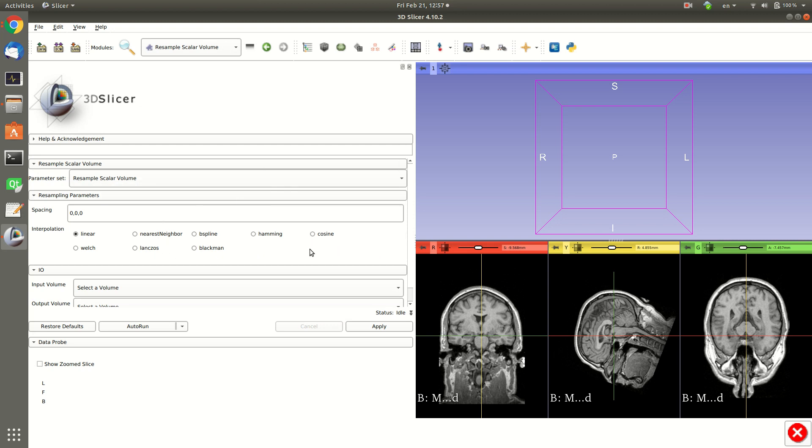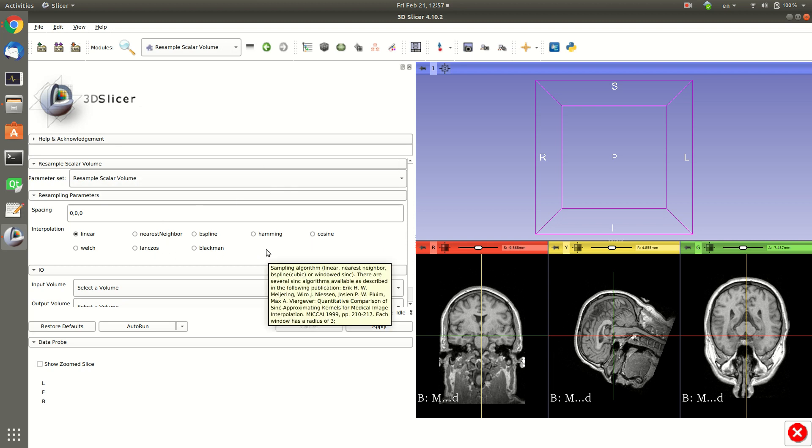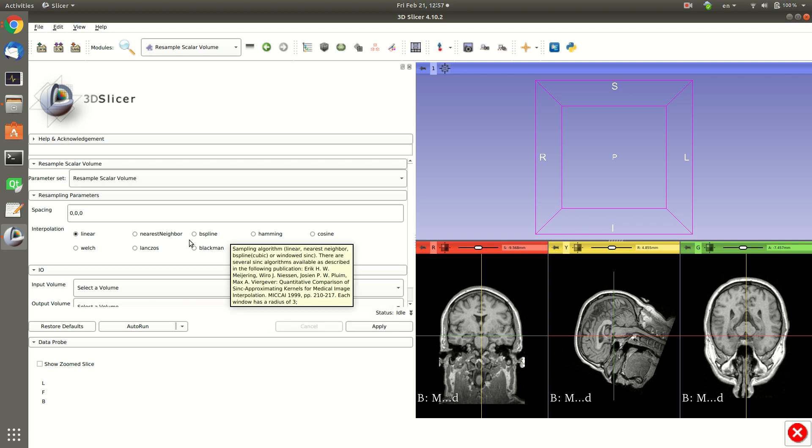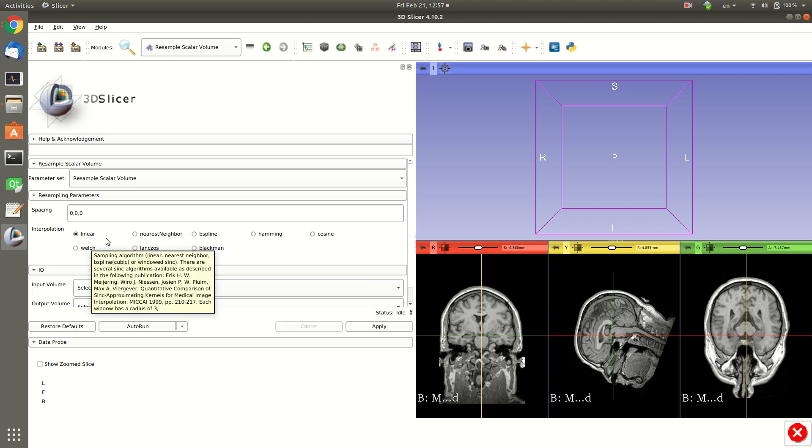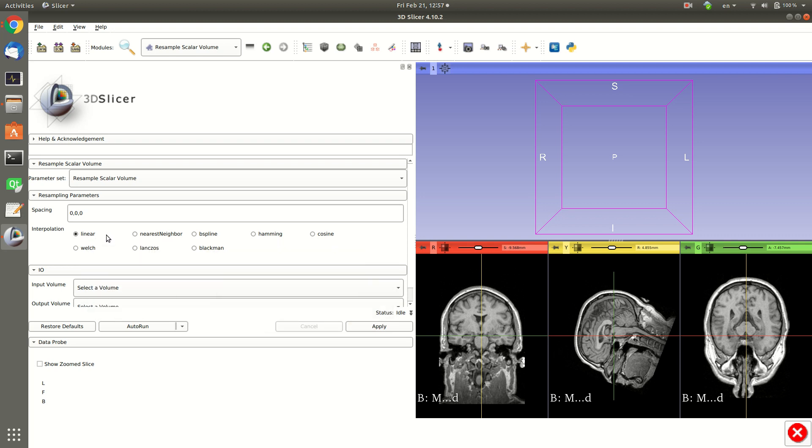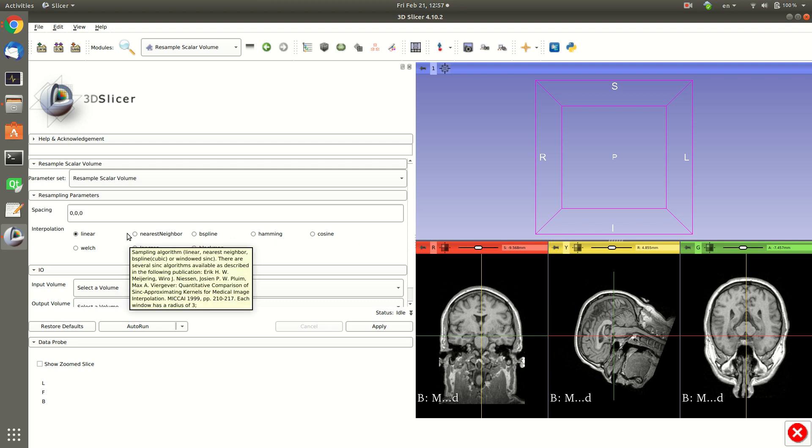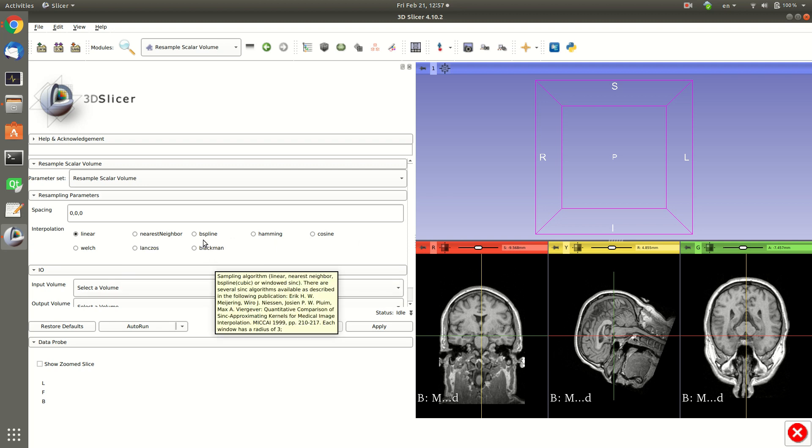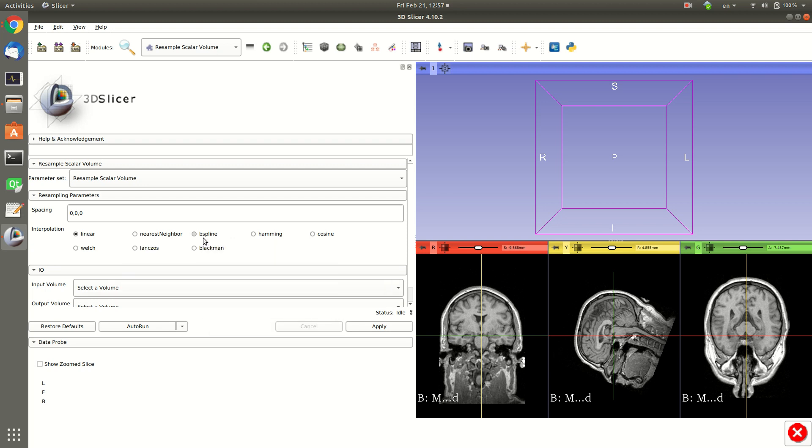So you can select the interpolation method: cosine, B-spline, or linear. Linear is very fast but not accurate. Basically between two points to create a line, I usually select B-spline for more accurate interpolation.